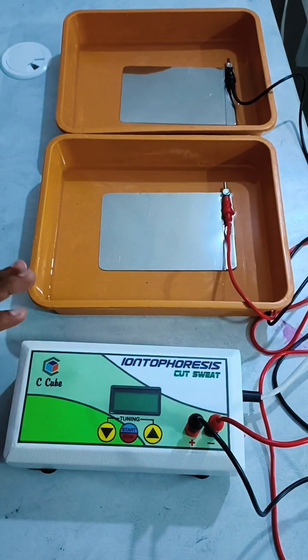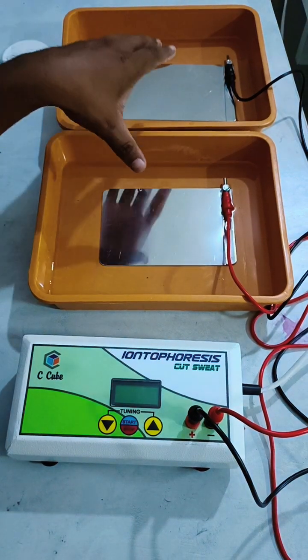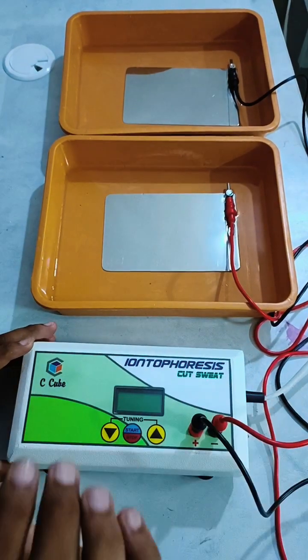This entire setup consists of a main unit, a delivery unit, and two trays fitted with electrodes, along with two connecting cables.